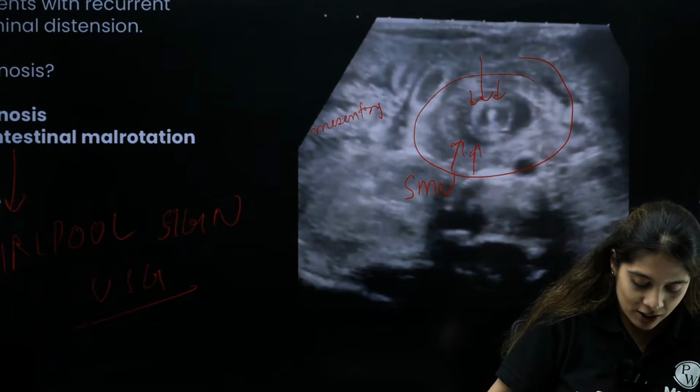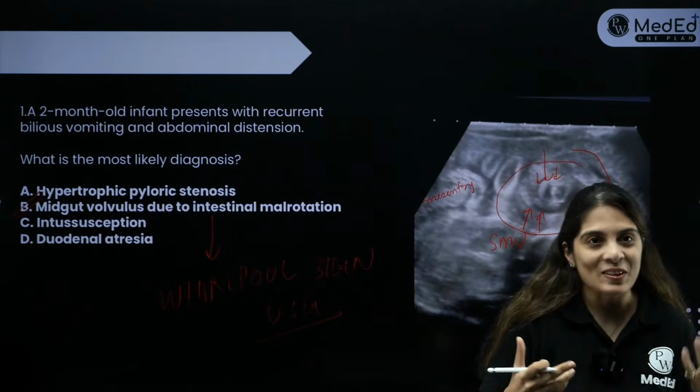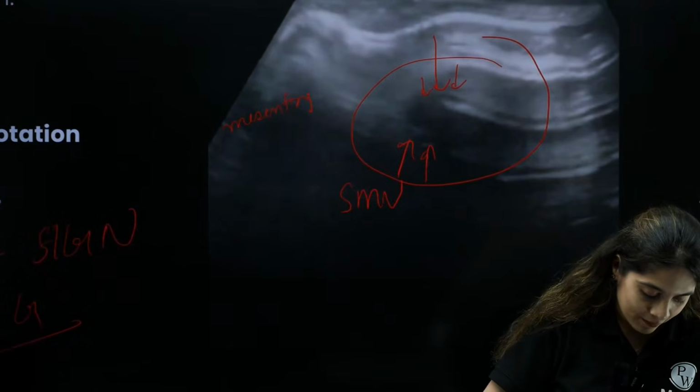Okay, so again I am just replaying this video for you. There are a lot of technical things which we are also learning because of the video-based questions. So you can see over here this. Okay, I will just show you again.